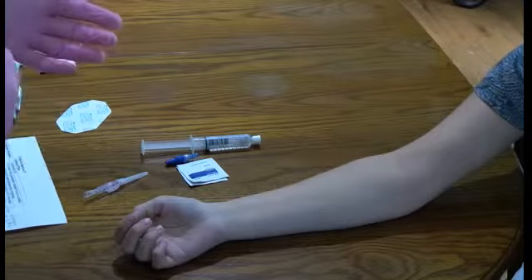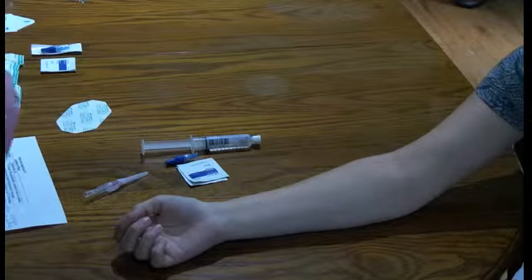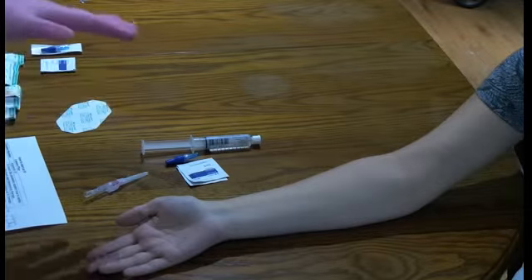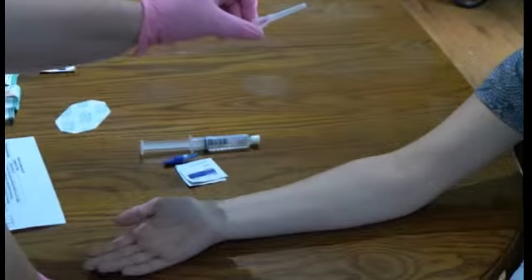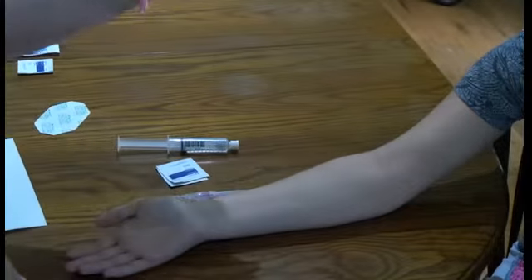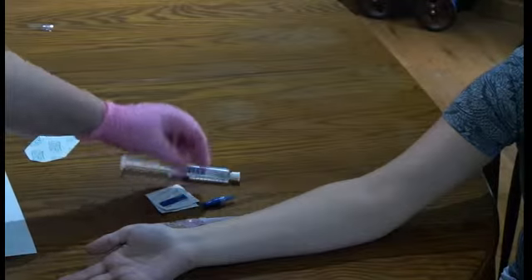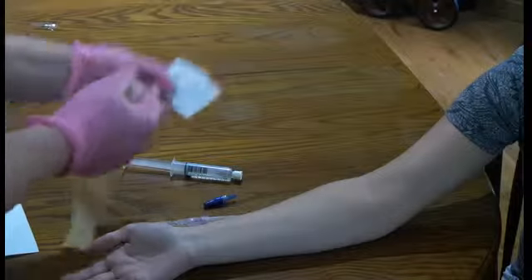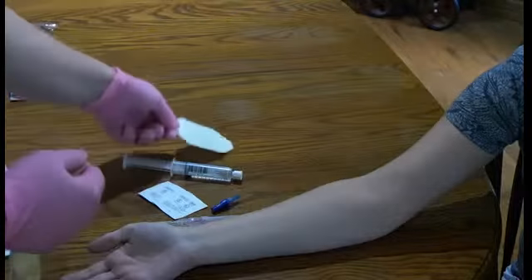What I'm going to do right now is demonstrate to you how to start an IV. The first thing you want to make sure you do is you have your gloves on and you have the appropriate equipment that you need to start the IV. You have your appropriate size IV catheter, your lock, your flush to check for patency, tourniquet, alcohol pads, and some sort of securing device.